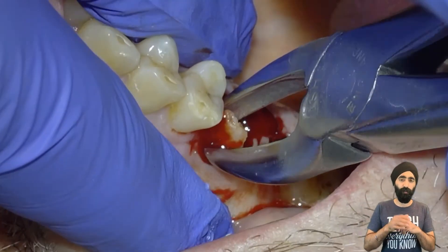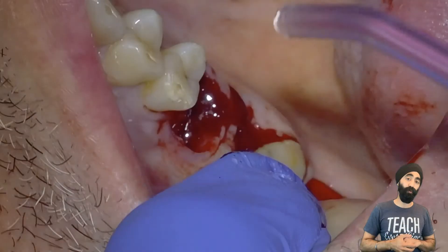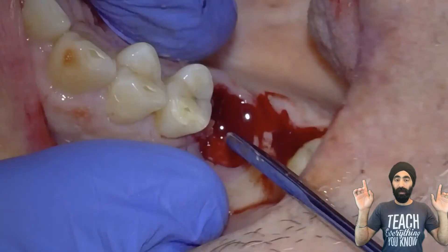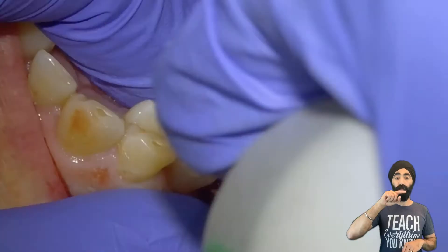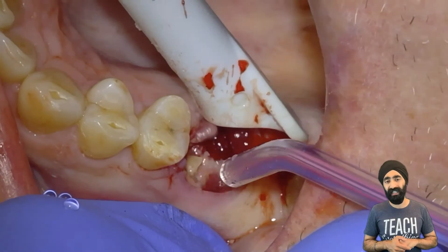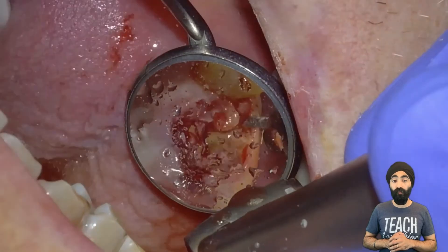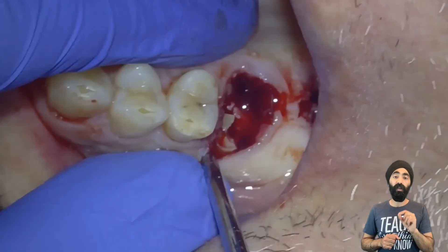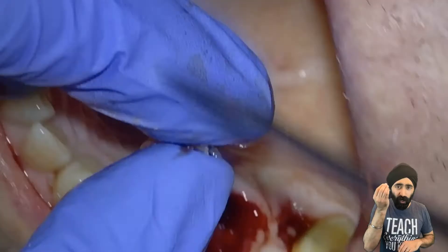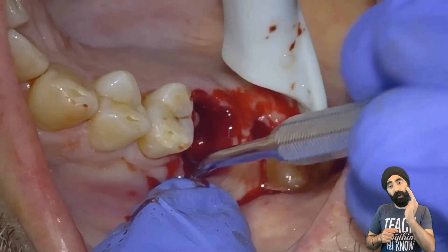This is where I came into a challenge because of that curve — I was applying some rotational movements and the actual crown broke off, leaving some roots behind. Don't panic here; I didn't panic. I just had a look, got the area nice and clean, got some nice visualization, and removed another fragment. You can see the root quite clearly, and that curve is stopping it from coming out. So what I did is I removed some furcation bone — I didn't remove anything buccal; I don't want to touch the buccal bone. Just by removing a little bit of that furcation bone, I was able to deliver that root.